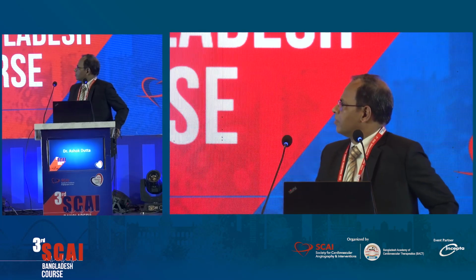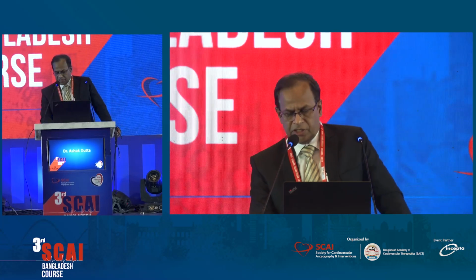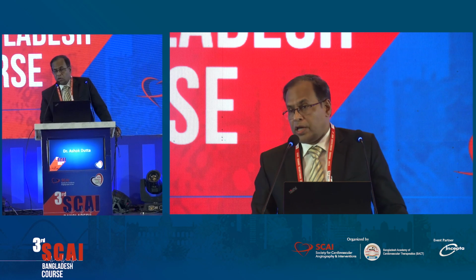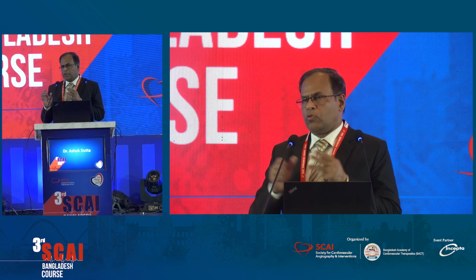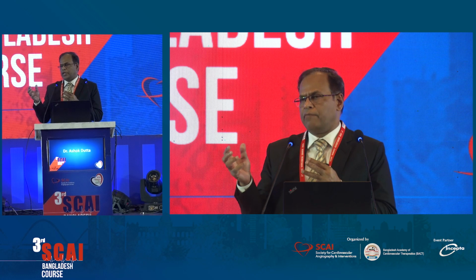What is the inflation pressure when you push or pull during retrieval of the materials? What inflation pressure do you keep? Yes, that is very important. If you see my last case, if the stent balloon is inside and it is lost distally or proximally, you just inflate at 0, 1 or 2 ATM.